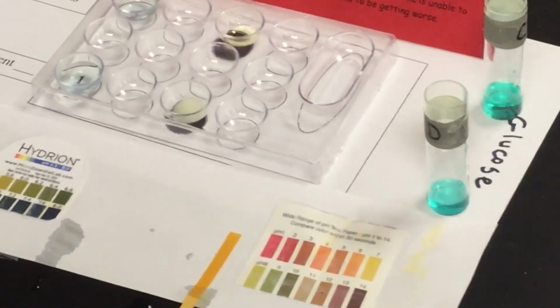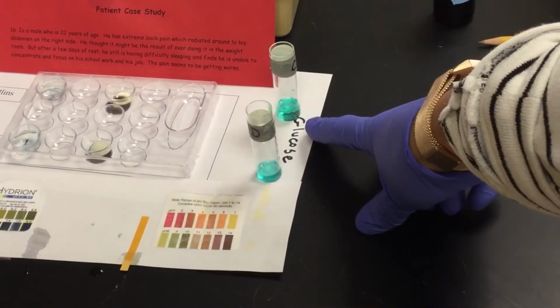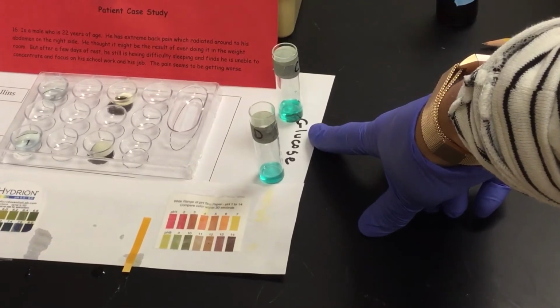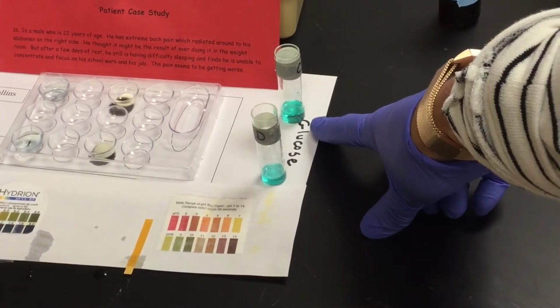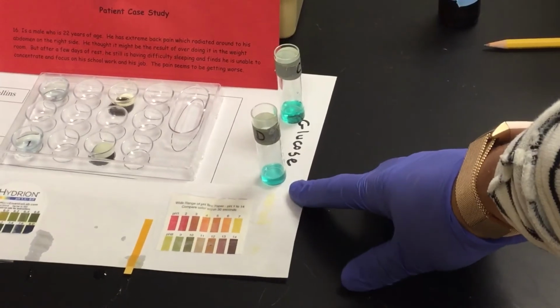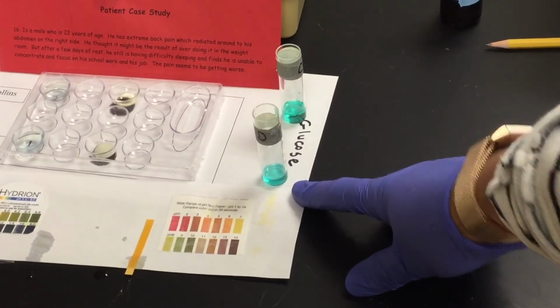The next test we're looking at is your glucose test. My top sample here is Mr. Rollins's glucose. Remember, that's urine with the Benedict solution in it, and Benedict's tests for sugars when added to heat. These have already been on heat and pulled. That is Mr. Rollins's urine, testing for sugars. This is patient number 16, looking for sugars. Remember, Rollins was our control patient, everything is normal on him.